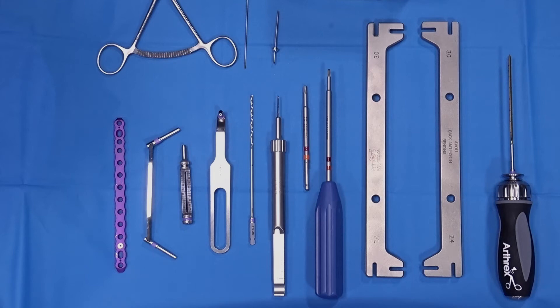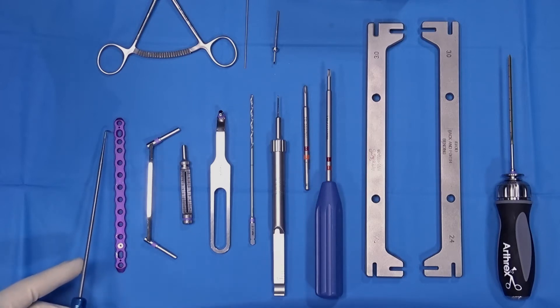Today we're going to present the Arthrex VET OrthoLine system, specifically the 3.0 titanium plate. As you can see here, we have a 14-hole plate. In this plate, we have a bending plug. This plate contains a universal hole as well as a compression hole and a slide hole.